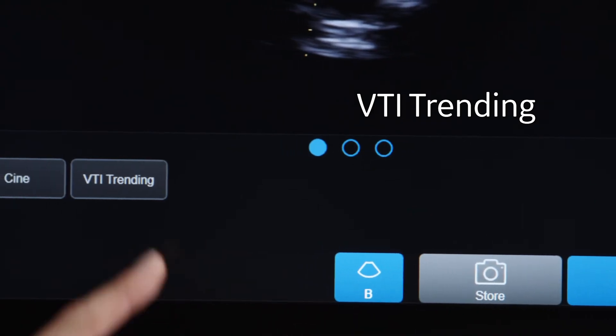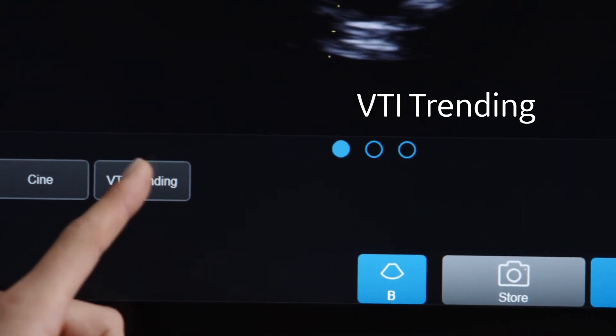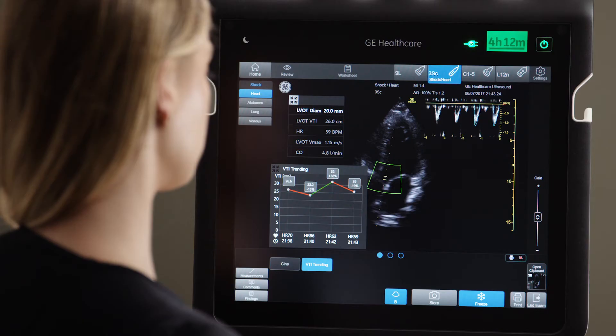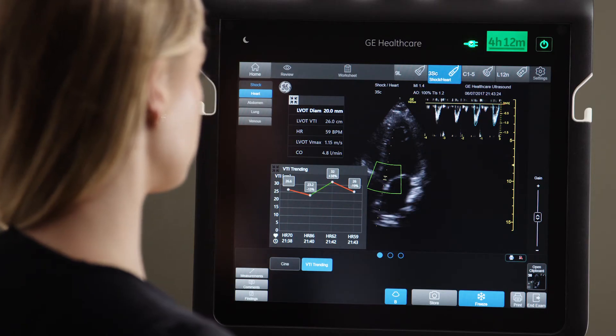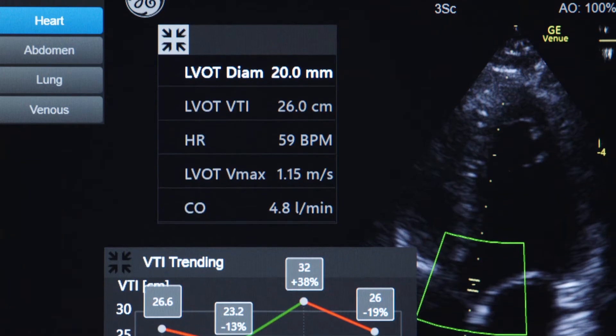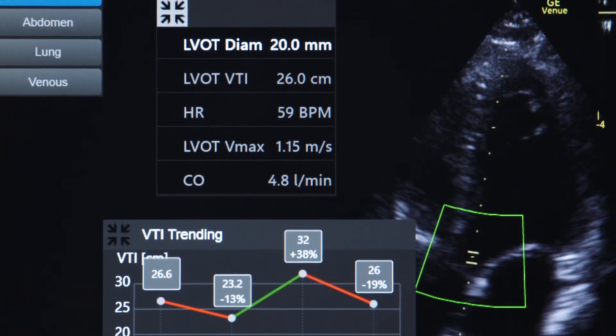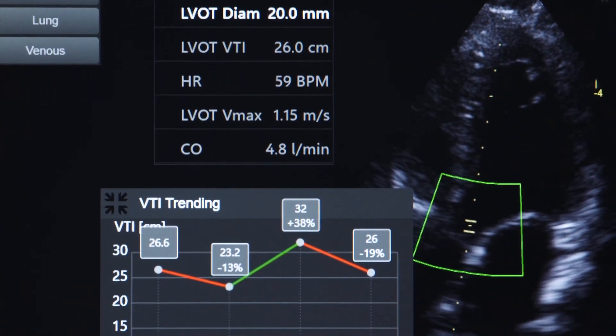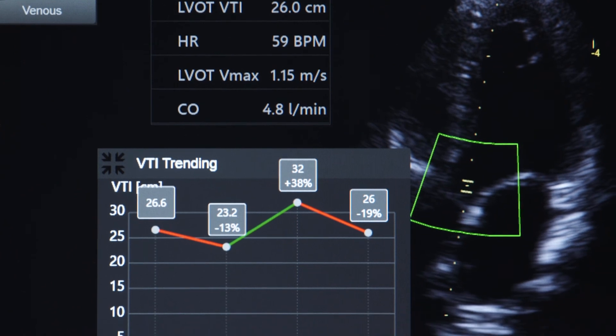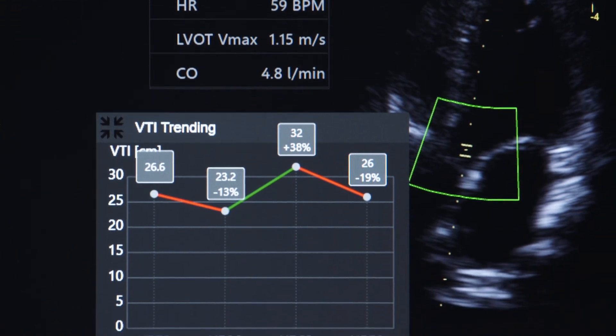With VTI trending, you can also trend your VTI calculations. This will allow you to quickly visualize a trend and determine your course of action.